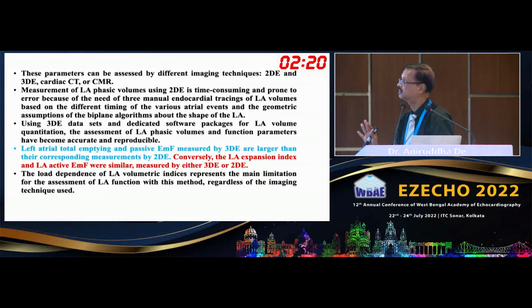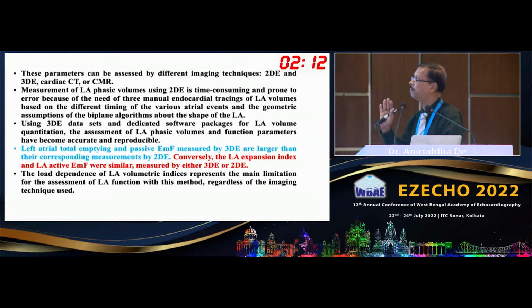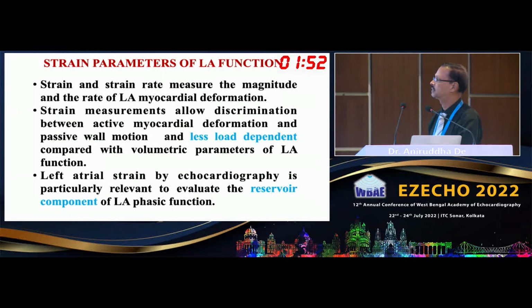the volumetric studies. So among these, remember that left atrial total emptying and the passive emptying fraction measured by 3D are larger than the corresponding measurement by 2D. Conversely, LA expansion index and the LA active emptying fraction were similar when measured by either 3D or 2D. So this is the same take-home message that I told you.